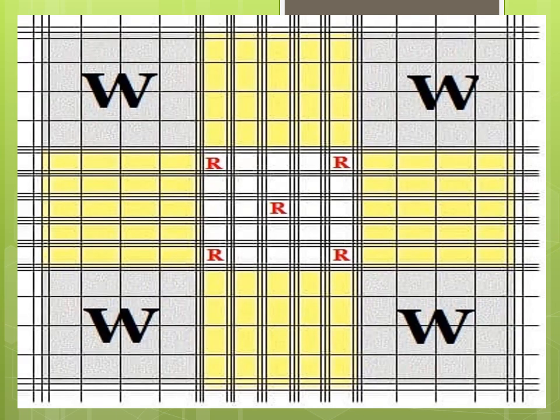This picture shows the hemocytometer chamber under the microscope lens at power 10. The four large squares in the corners, with the letter W, represent the area for counting white blood cells, and the middle large square, which consists of multiple medium squares with the letter R, represents the area of the hemocytometer chamber for counting red blood cells.